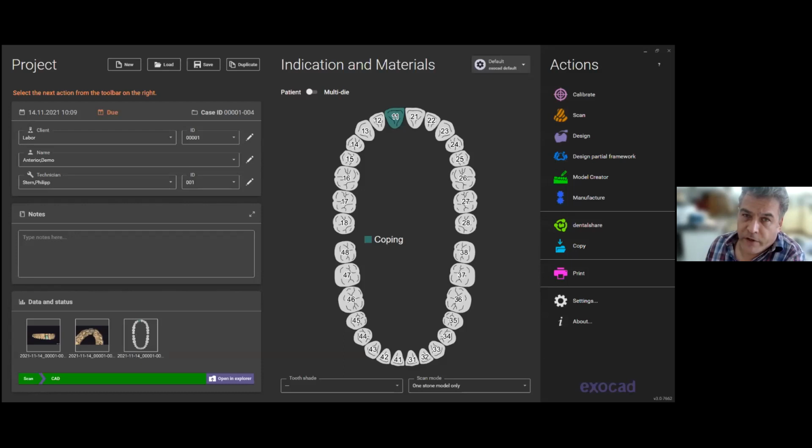Unfortunately, I'm not able to show you the scanning process itself because we only have one camera connected here. So I cut out what is not necessary, and then it will ask me to put my die in the multi-die platform in the middle. Some more spray.